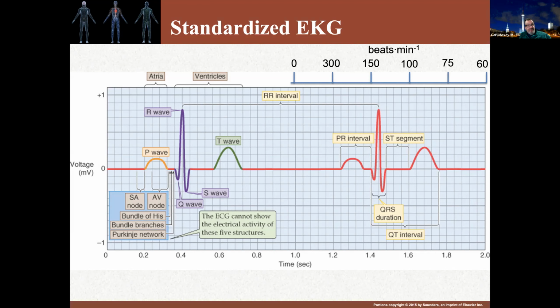Another thing which is occasionally going to happen in the EKG tracing is you may see a dropped beat. Now, what this means, when the dropped beat occurs, is that you have failed to generate a signal in some way or other.